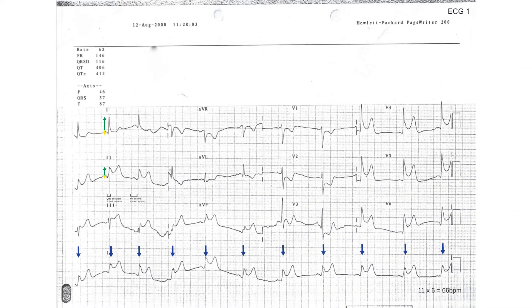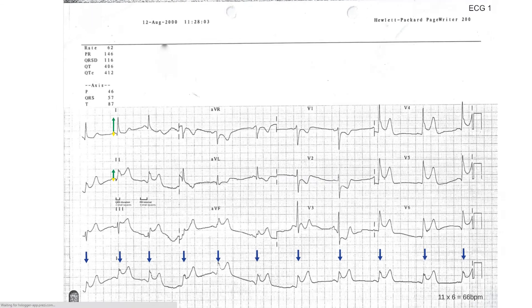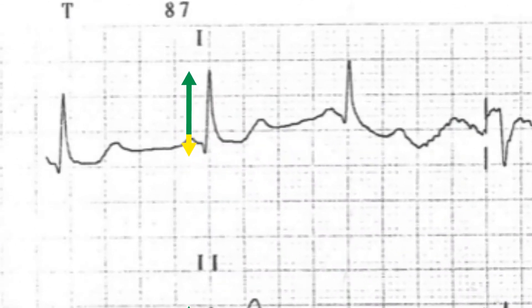There are no pathological Q waves present on this ECG. There is a small Q wave present in lead 1 but it is small enough to be disregarded.